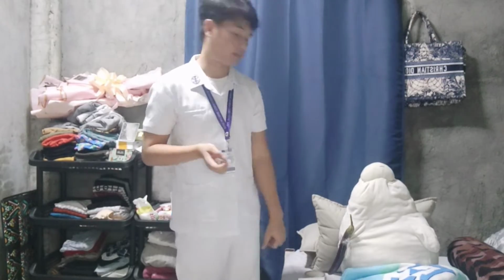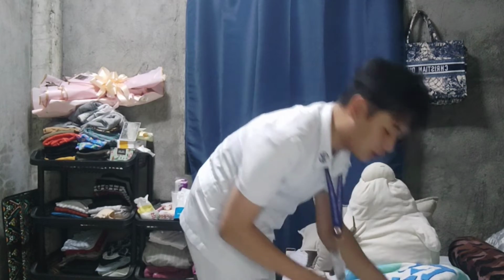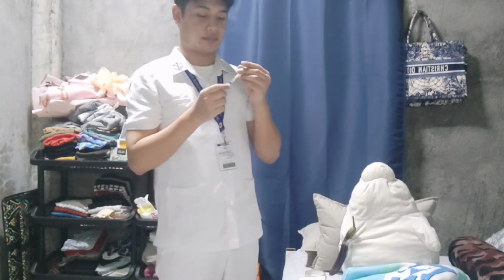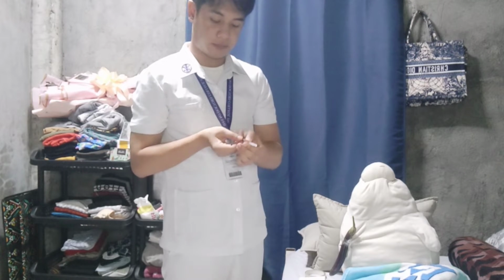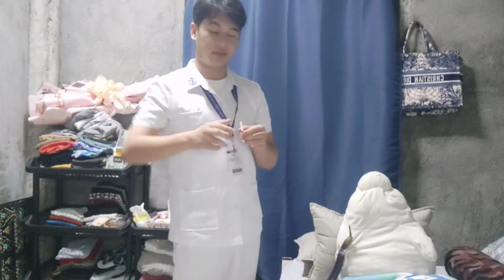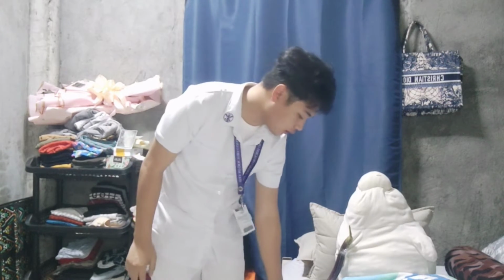So next is we need another regular cap. So we're going to get the regular cap. Make sure that the cap is tight. So let us put it here.